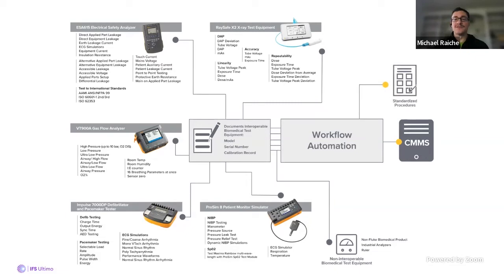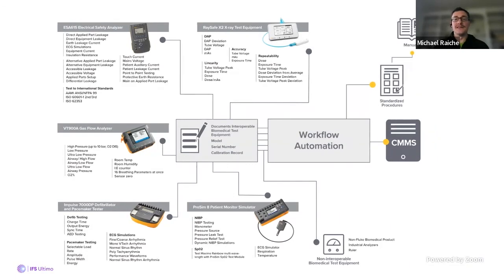So you have a standardized procedure. We talked about that. Everything you want for your facility, you can build in. So it can be driven from the manual itself, but you can also build in any tips or tricks or things that your facility needs over and above what the manual needs. So if you want to add a visual inspection, you can go ahead and do that.